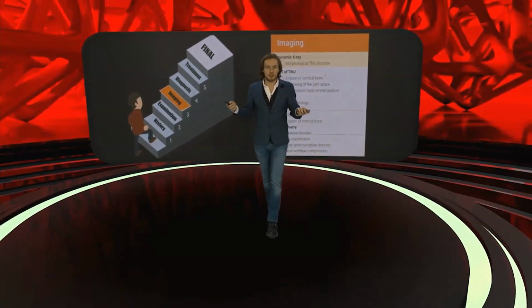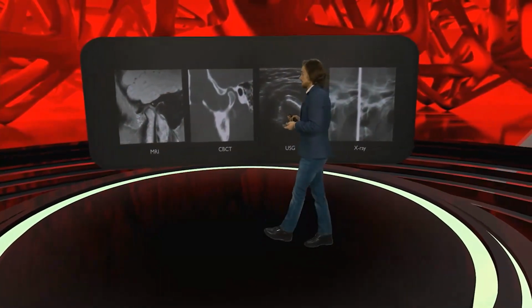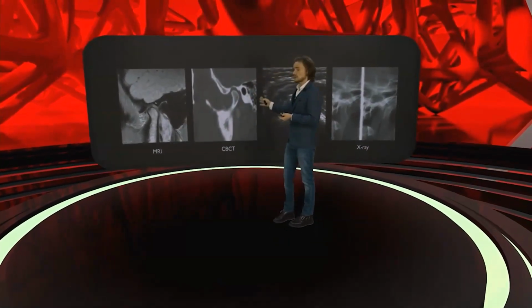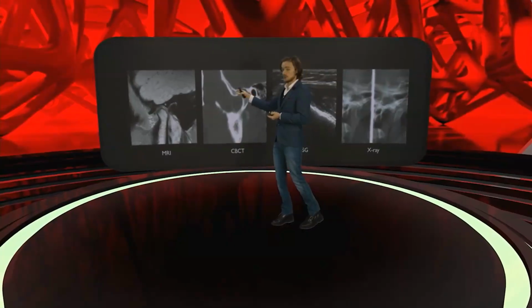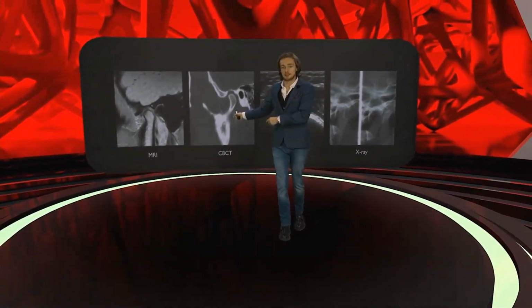So, talking about imaging, we have a couple of different possibilities. We can have the MRI, we can have the CBCT. I hope you see the difference, because on a CBCT we mostly see the hard tissues.